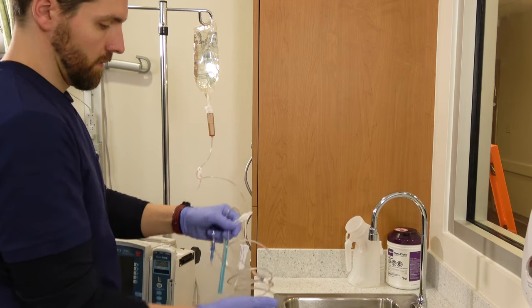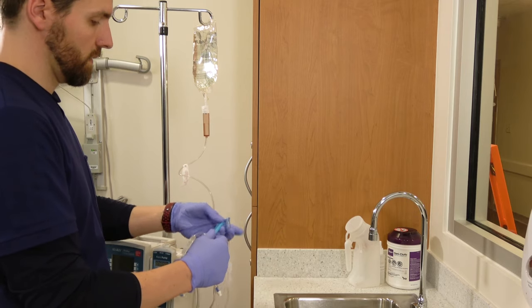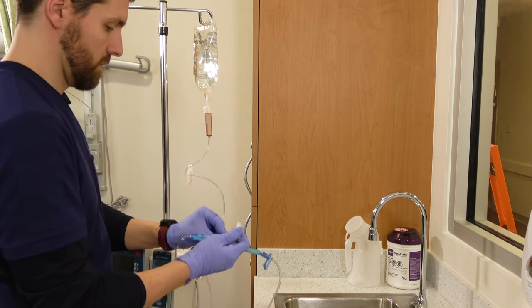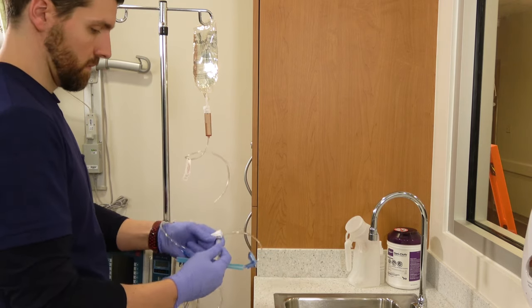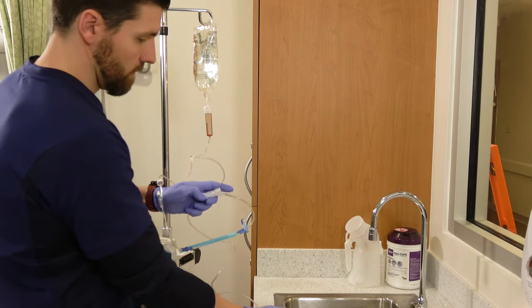Holding the end of the tubing over a sink or a trash can, slowly unclamp the roller clamp until the fluid starts flowing. Always do this slowly — if you go too fast you're going to start getting air bubbles in the chamber and you'll end up with air bubbles in the line itself.